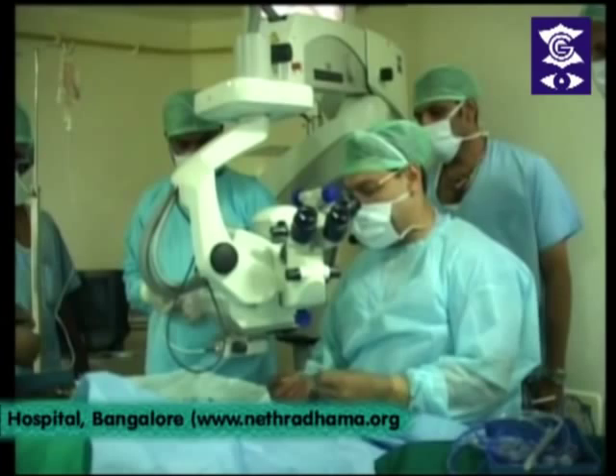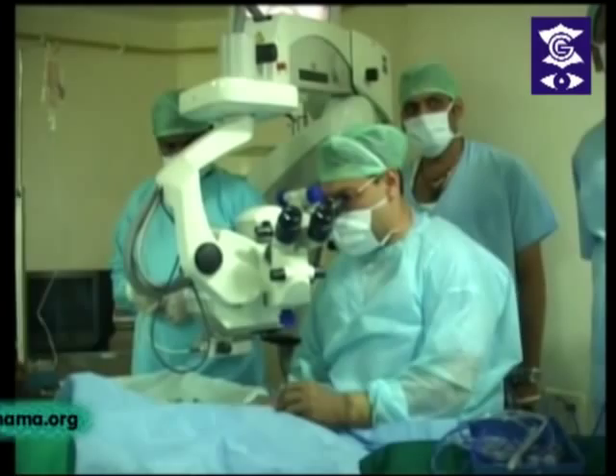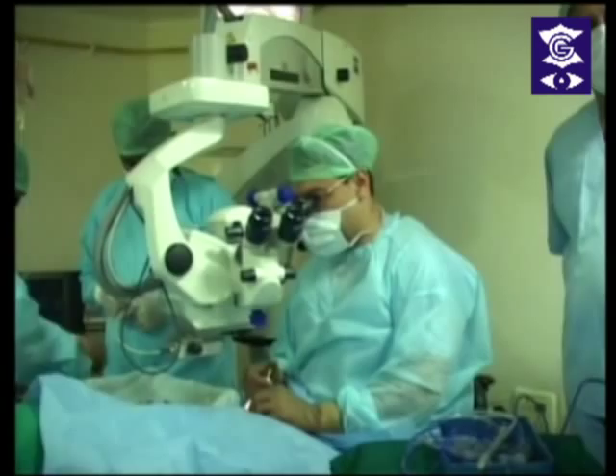This gentleman has about a grade 2.5 to grade 3 cataract, and I'm going to use the Vizales system which has converted me from peristaltic in the last few months to a Venturi user. I never used to like Venturi machines because it didn't give me the kind of control that the peristaltic pump on the Infinity would give me. But with this machine, I've changed my mind. It gives a nice hold and works rather well.